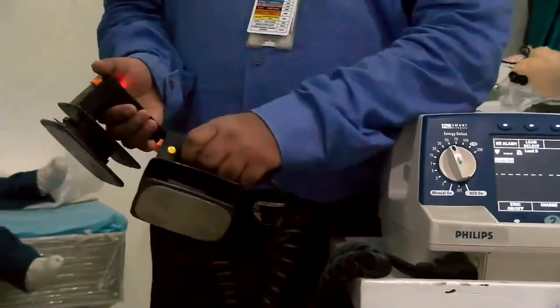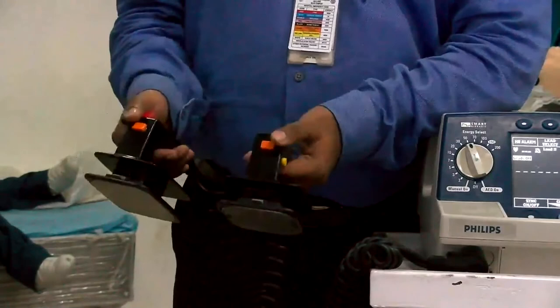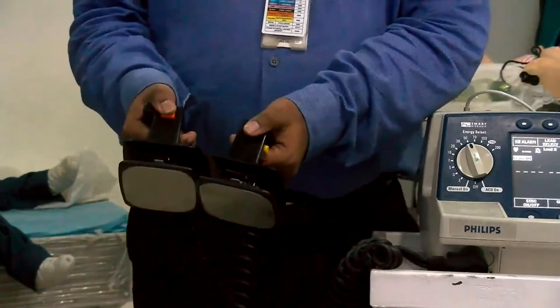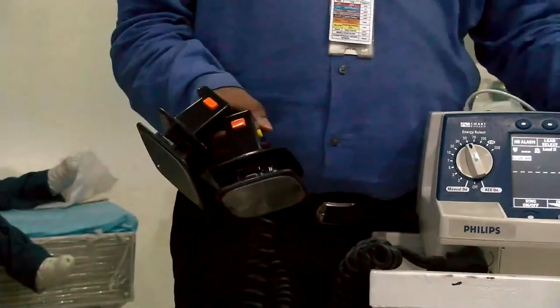After charging, you will deliver the shock by pressing these 2 orange buttons. Before that, one important step is to make sure everybody is clear and the oxygen is off, as it can be dangerous to the team as well as the environment. You need to be very careful about that.